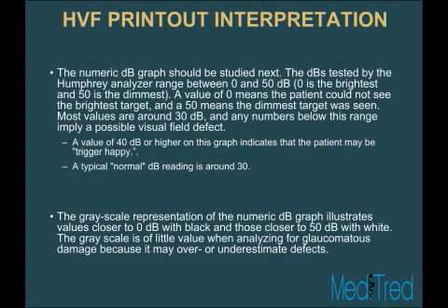We heard this before earlier in the talk from Dr. Suhu about the decibels and what's important. Points here that I have listed under the first bullet is really important as far as a pearl that you can take home. A value of 40 decibels or higher on this graph indicates that the patient may be trigger happy, and a typical normal decibel reading is around 30.